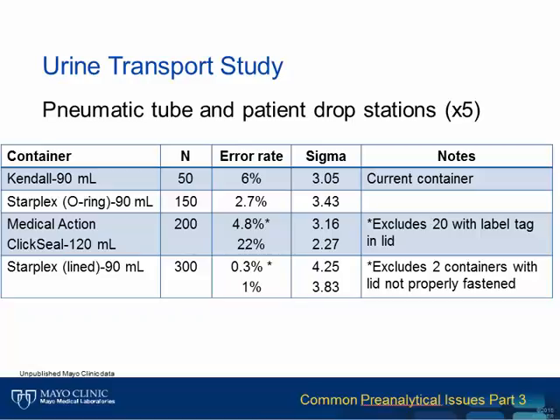We were reasonably happy with the improved performance of the last container with a 1% error rate, having the potential to be even less if users could be taught to look for and correct cross-threaded lids prior to sending, though it didn't happen frequently enough to preclude its approval.